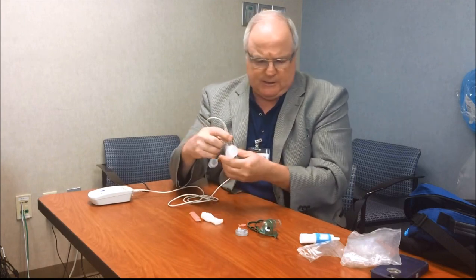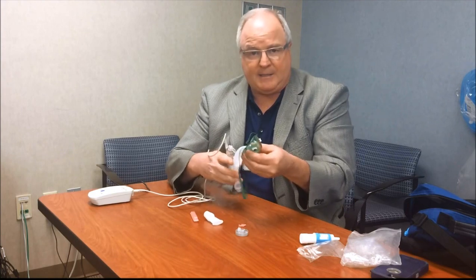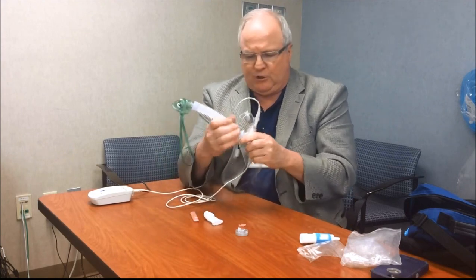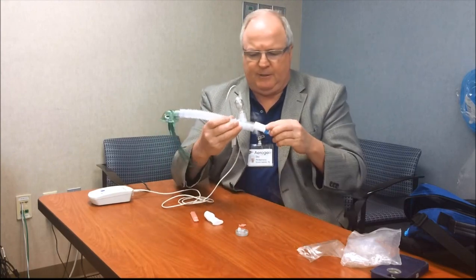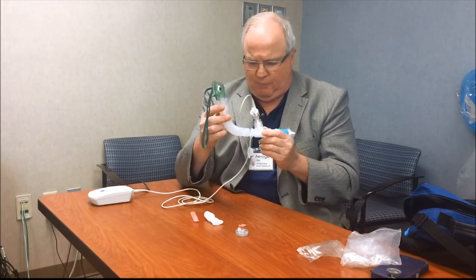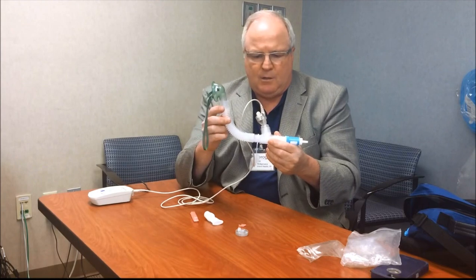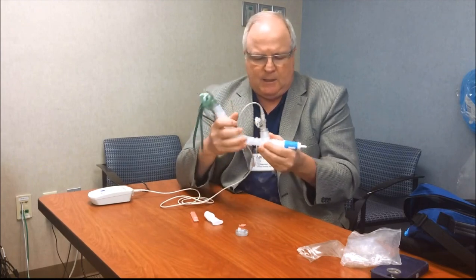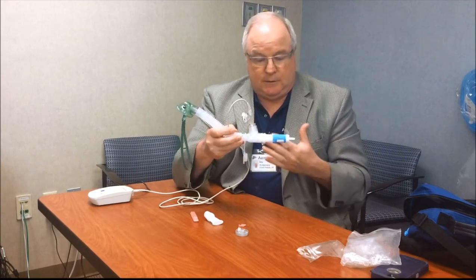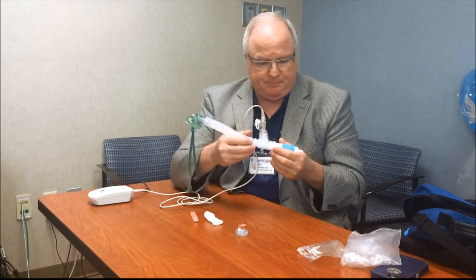Another way you could use this, if the patient, say, was on a mask treatment, or on mask, either a set FiO2 via Venturi clip, you could take your Venturi, plug it right in line, and then have it delivered. Now again, you can see there's no flow. As soon as you add a little flow, you'll get the aerosol to the face mask. The nice thing about this is you have a known FiO2. You can continue to deliver your known FiO2 and also provide a treatment in line.